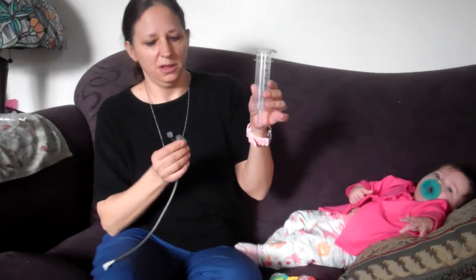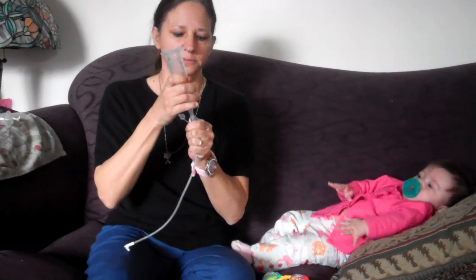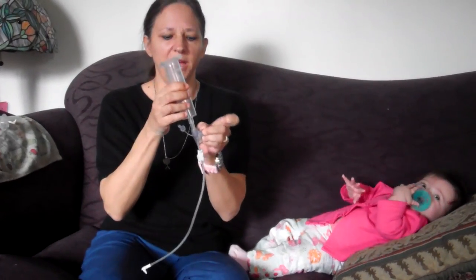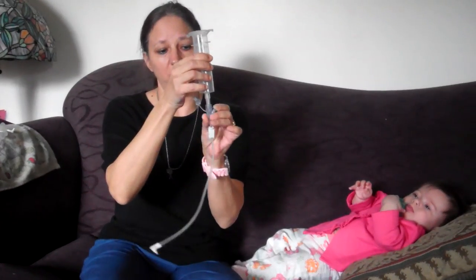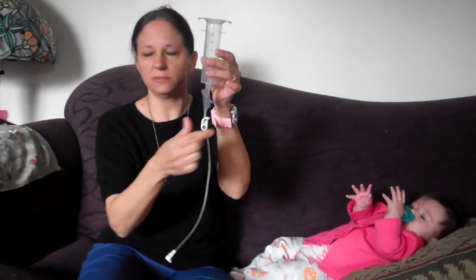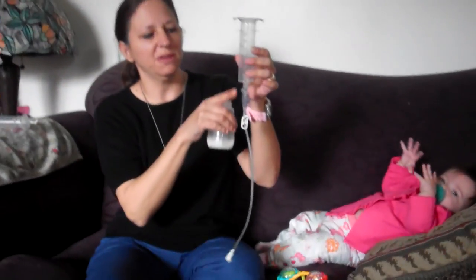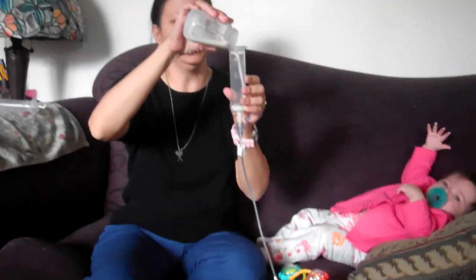We start with this and this, 2 pieces, and they go together. You put it in there really tight. Make sure they're dry. When you get this out of your package, make sure that this is closed, because when you fill it up, it'll pour right out of there. And you want to close this, and that will clamp it. And when you put them together, make sure they're dry if you wash them. Yeah, make sure that they're dry, because if this isn't dry, it'll come apart during your feeding, and you don't want that.